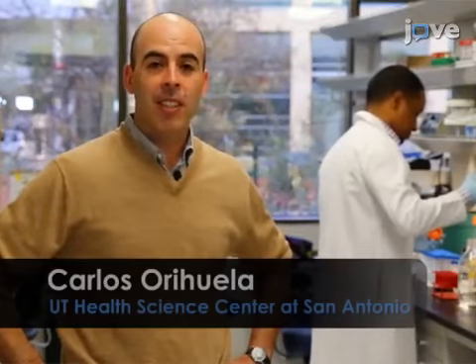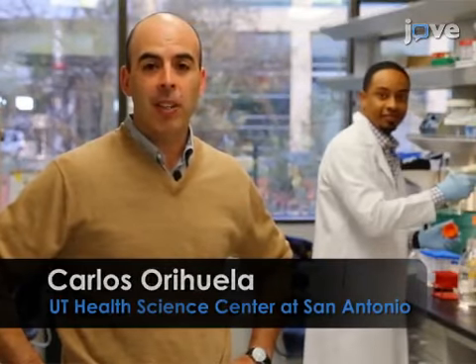Demonstrating the procedure is Armand, a graduate student in my lab. Though this method can provide insight into the cardiac damaging effects of S. pneumoniae during invasive pneumococcal disease in mice, it can also be applied to cardiac samples from other systems, such as non-human primates or humans.